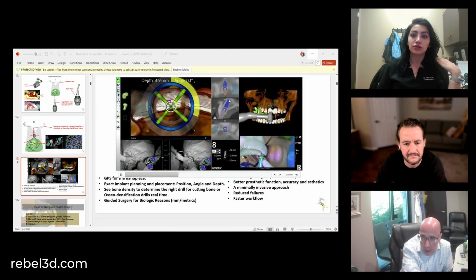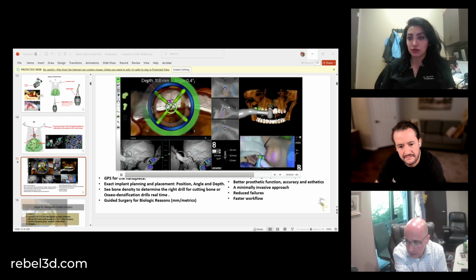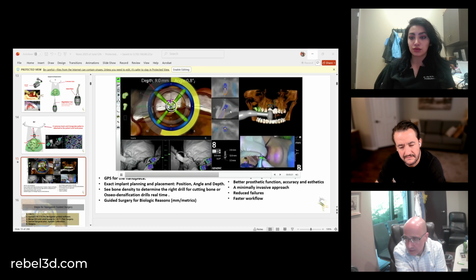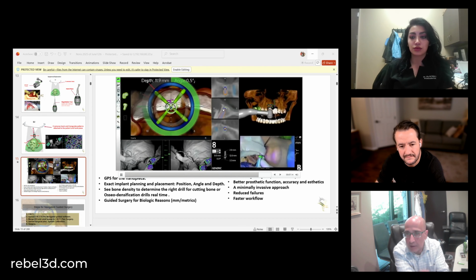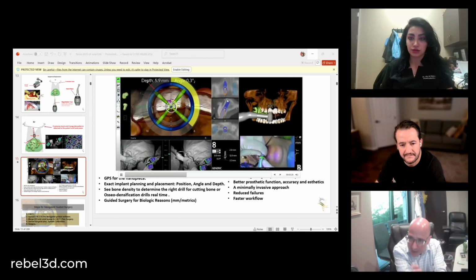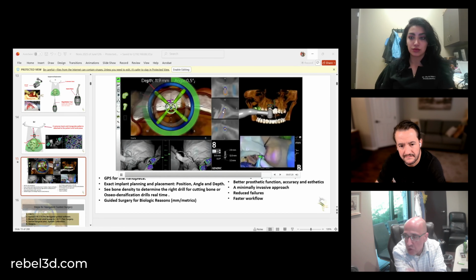In this one, I need to have an overdrill, because if I put just a regular drill with this kind of dense bone, I will have bone necrosis. So I see that this one in particular needed much more drill or oversizing to get the implant in with a decent torque. Imagine with this particular one, this bone density is not like that. It's very mushy.